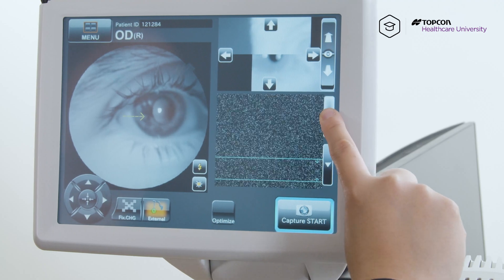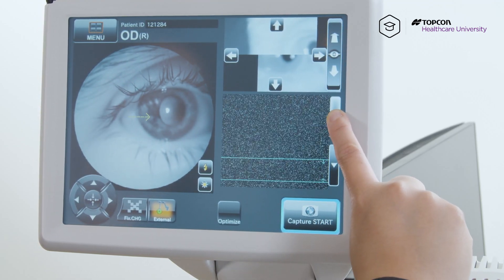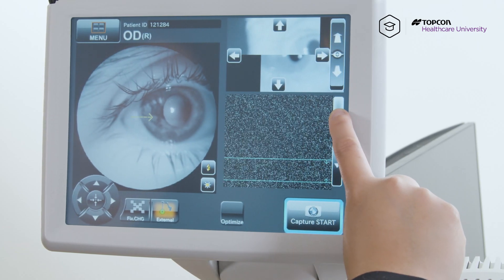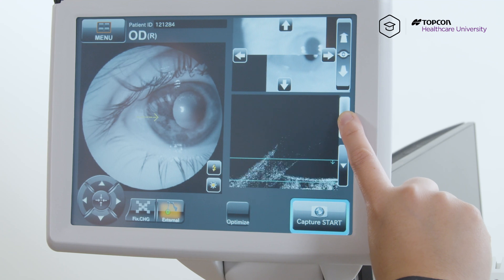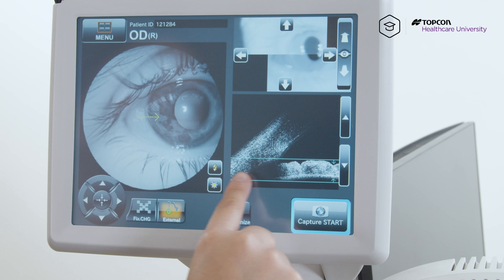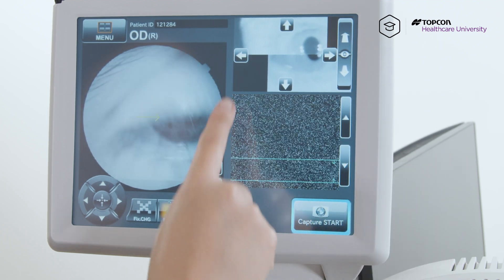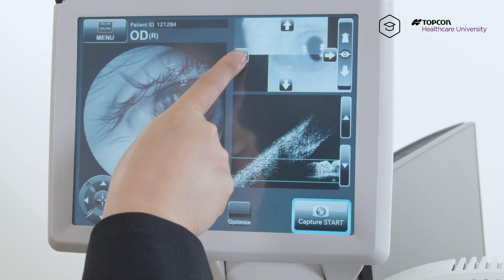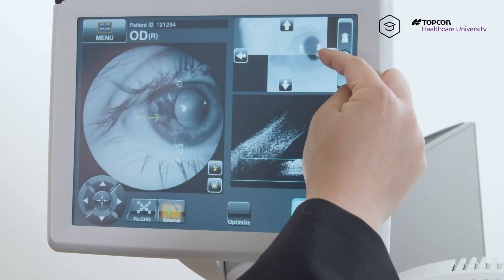Start to zoom in by holding down the up arrow until you start to see an image form. What we're looking for is going to look like an alligator's head. I held it down, and now I have his iris in between the blue lines here. We have a cornea right here. If you needed to move the image left and right, you can always hit the left and right arrows here to move the image.